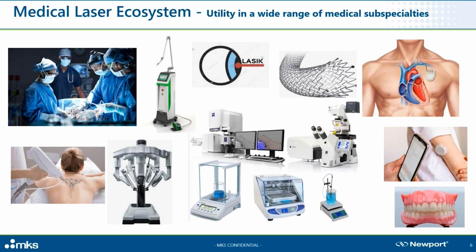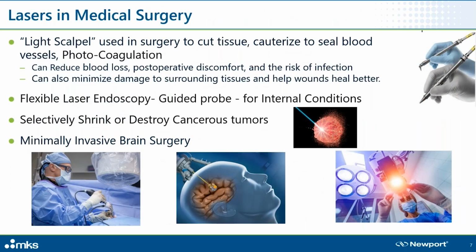More recently, pharma companies are even using lasers to discover new drug therapeutics and other medical research. Here's the most obvious application: laser surgery, cutting and cauterizing. Current technical advancements have created these handheld laser tools.